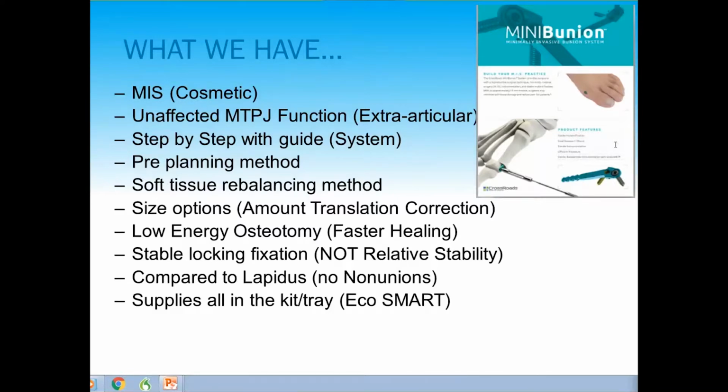The issue with that is that the bone becomes narrower, meaning the diameter of the bone. So yes, you can translate it, but the osteotomy tends to be sometimes more unstable, meaning it can angulate plantarly or dorsally a little bit easier, like I showed in those previous examples. So you just have to be a little bit more mindful of that.